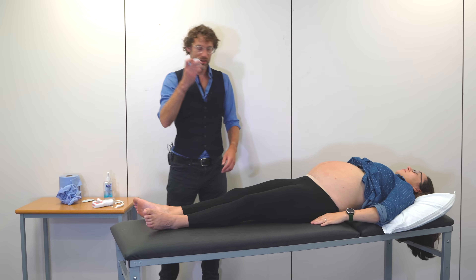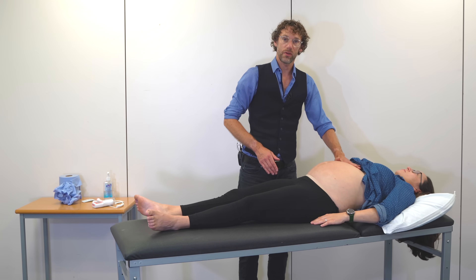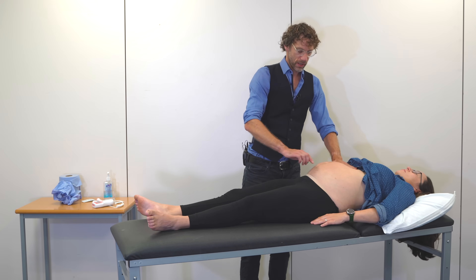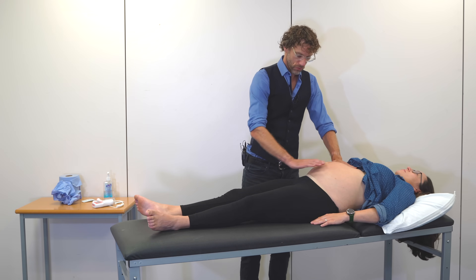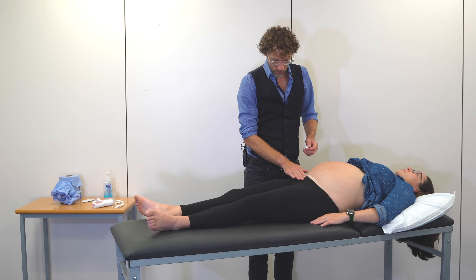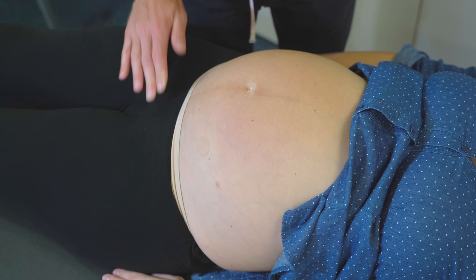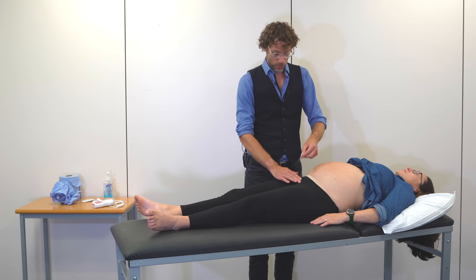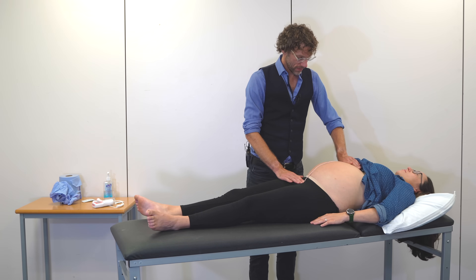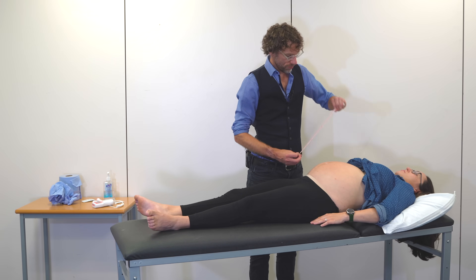With the Doppler done, we get our tape measure and find the fundal height. Starting from the top of the abdomen and pressing down with the leading edge of my index finger, I feel the shelf — the top of the uterus — which has risen up to here. Having roughly located it, I take the measuring tape and find the symphysis pubis. Are you happy for me to feel down low? I can feel the bony hardness. I take the tape measure with the blank side facing upwards, press at the symphysis and run it up to where I found the uterine indent. Turning it over, that's showing me approximately 33 centimetres.